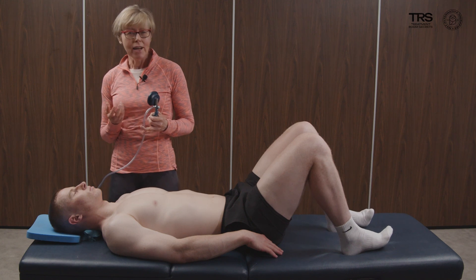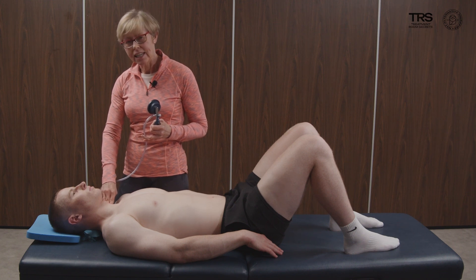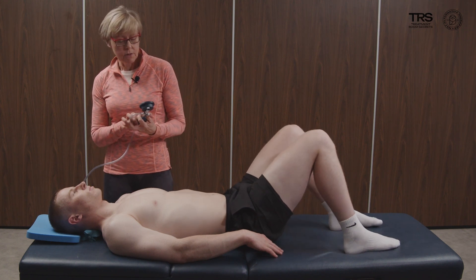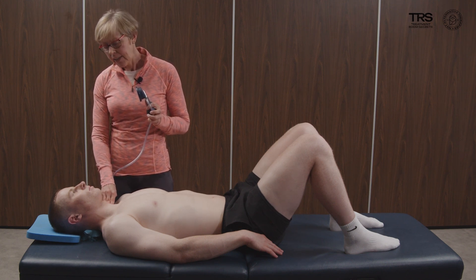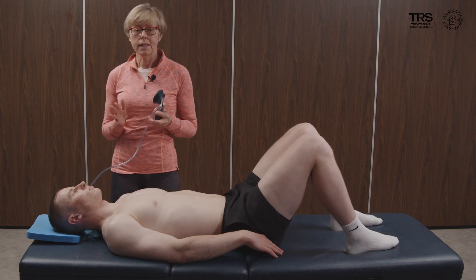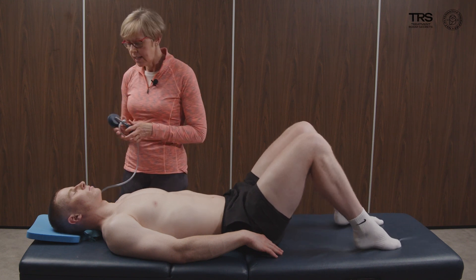What we want to inquire about is what's happening in the superior superficial muscles of the neck, and in particular the sternocleidomastoid, which has a habit of taking over as you probably know. In this next test, Jack is going to move from the bottom of the red in two steps of two millimeters of mercury at a time as I palpate, and I'm going to notice what's happening. When you're ready, nod to the top of the red, then the next color — moving two millimeters at a time — and again, and then release and relax. You would expect that when they achieve 28 millimeters of mercury, they are probably going to be getting some activity of the sternocleidomastoid towards the end of that movement.